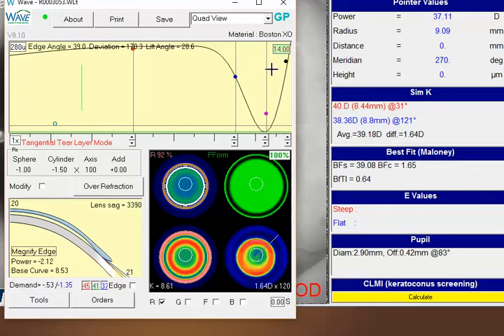So if you're going to stay in a scleral lens, I would probably go larger, and maybe even consider switching over to freeform. That may give Wave a chance to pick up a little bit of this design here. I find though, from personal experience, a lot of these patients do just well with a very large diameter on-cornea lens, about 11 to 11.5 millimeters. That allows Wave to look at this topography more specifically. I always go freeform, and that'll give you a kind of reverse geometry on-cornea design. I've also been very successful with a mini-scleral, kind of the 14 diameter, but using a little different fitting approach.